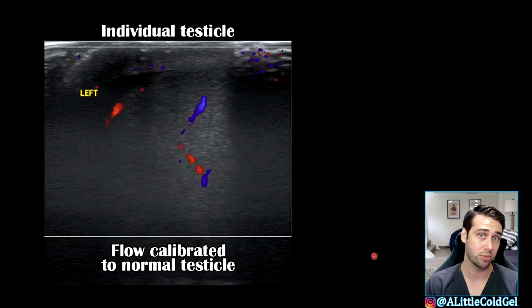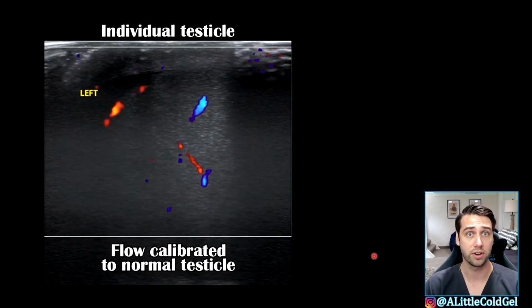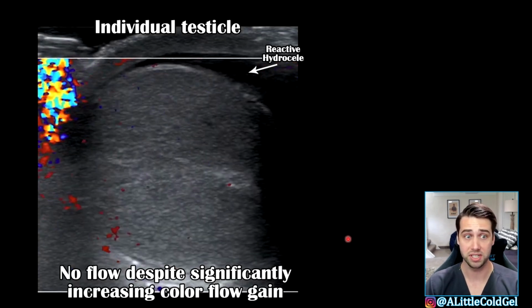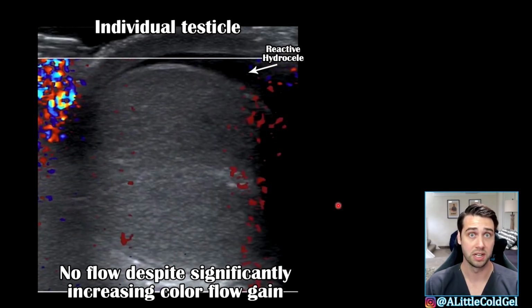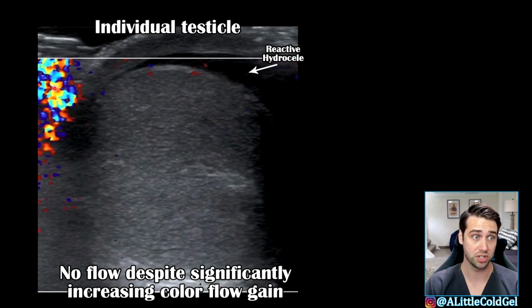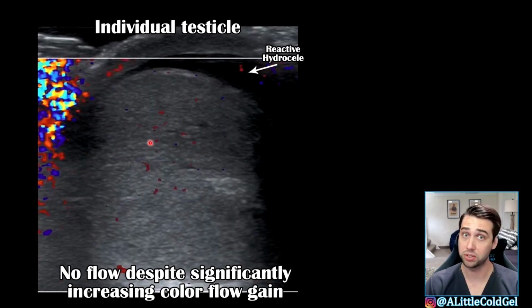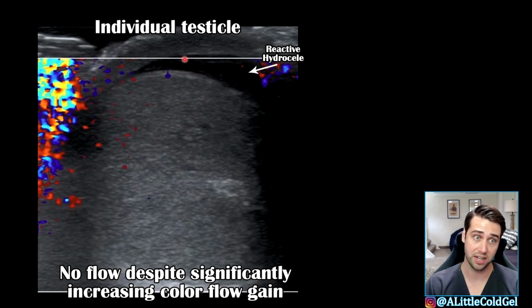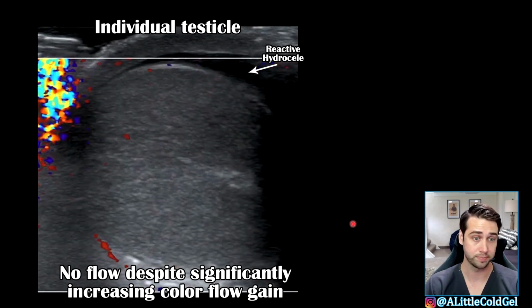So once we have it calibrated to the appropriate gain on that normal testicle, you're going to move over and image the testicle in question for torsion. So when we move over here, you can see that this testicle has basically no flow. And you can also notice that the sonographer here has cranked up the color gain a lot because there was no flow. And you see all this extra noise over here in the tissue that is obviously meaningless. And there's still no flow in the testicle. So that's very concerning. And here you notice also there's this reactive hydrocele. And a hydrocele is basically just some fluid in there. And that's another sign of torsion.